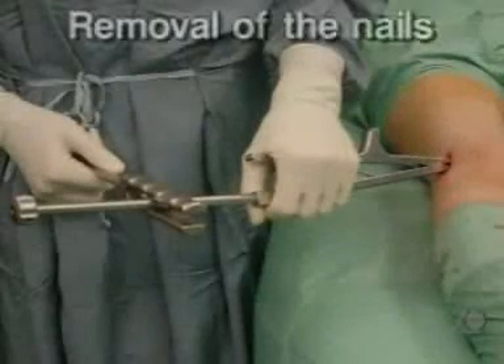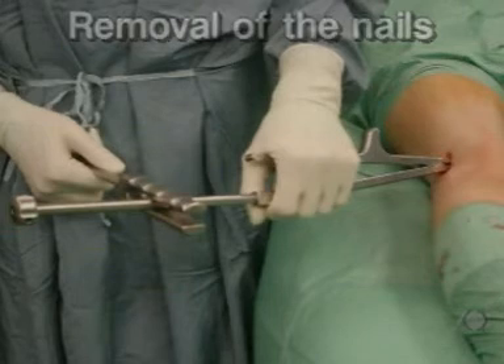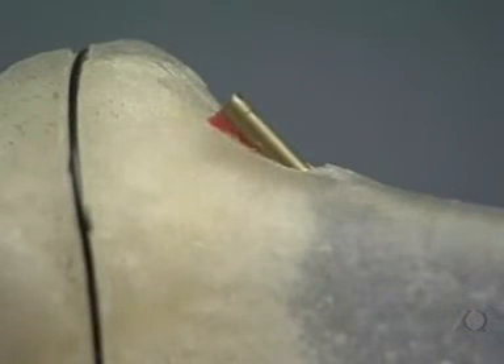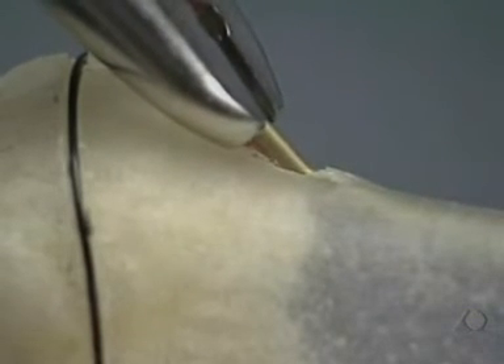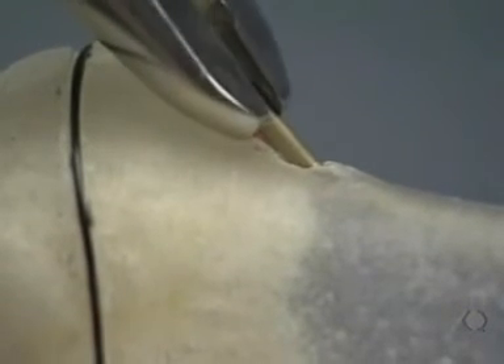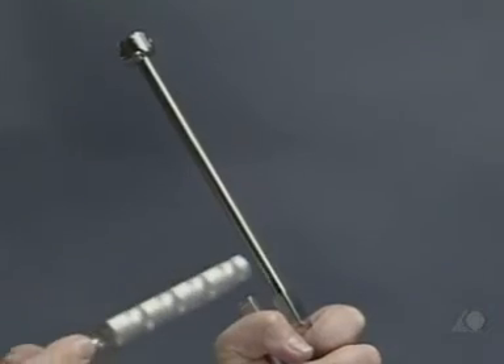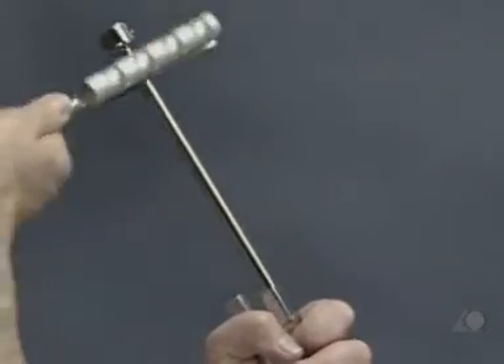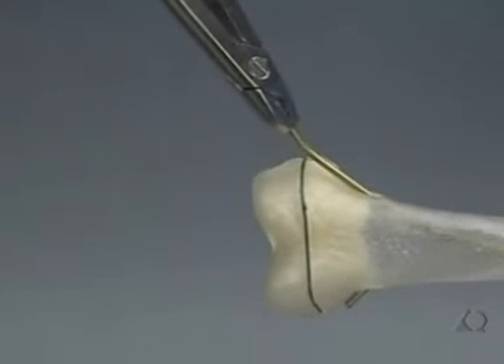The removal of the nails is the same for all fractures treated with the TEN system. Irrespective of the fracture type, nails should not be removed until four to six months following the operation. After the old incision has been opened, the end of the nail is exposed and held with the extraction pliers. The end of the nail should first be bent so that it is lifted clear of the callus. With the hammer guide firmly screwed onto the extraction pliers, the nail can be easily removed with strong axial blows along the guide.